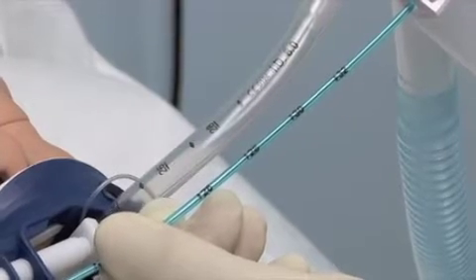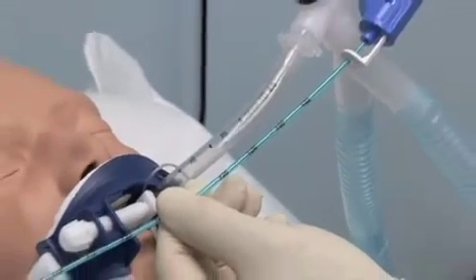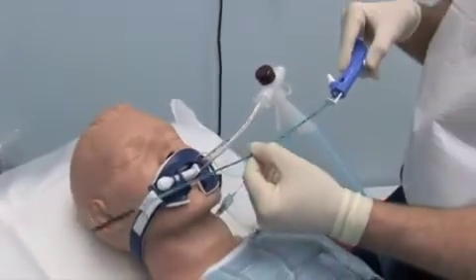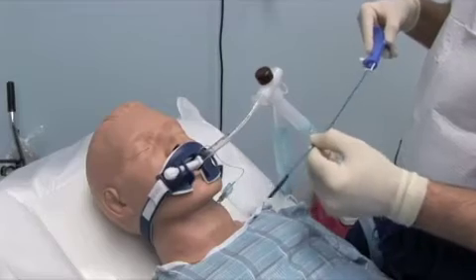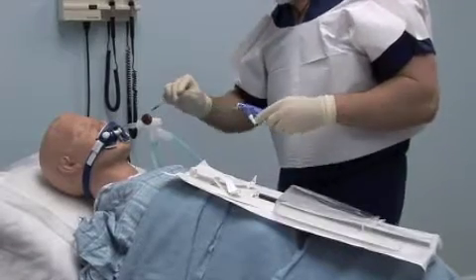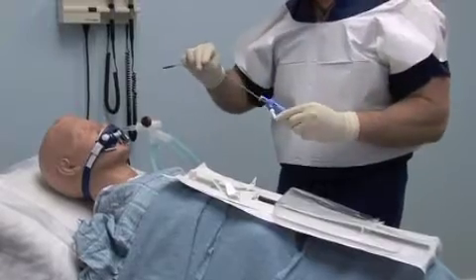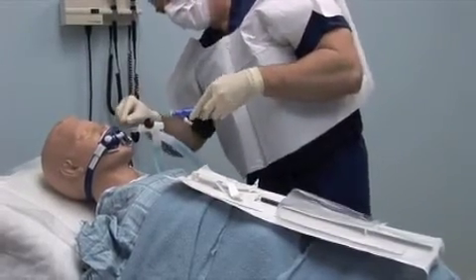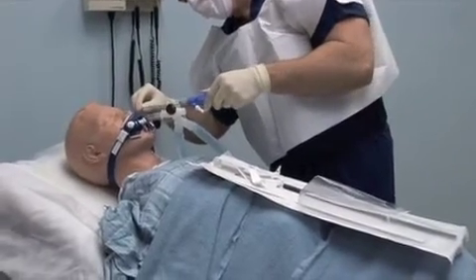Hold the CAM Rescue Cath next to the patient's endotracheal tube, taking care not to contact the patient or any item with the sterile catheter tip. Align the numbered markers on the CAM Rescue Cath with the corresponding numbers on the endotracheal tube. Depress and advance the depth calibrator tab until the depth calibrator disc abuts the top of the endotracheal tube.